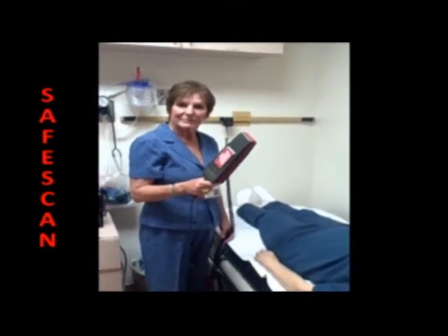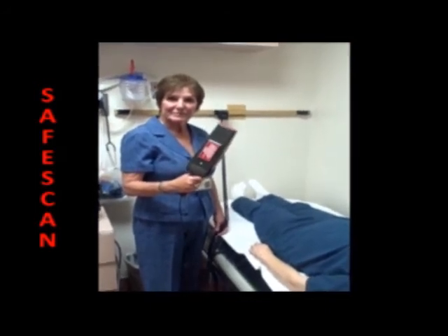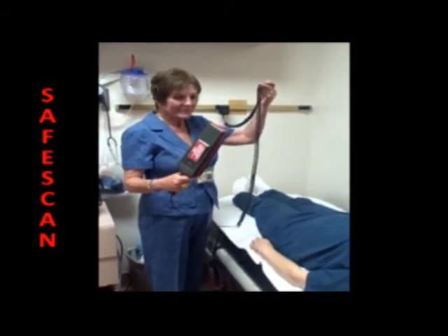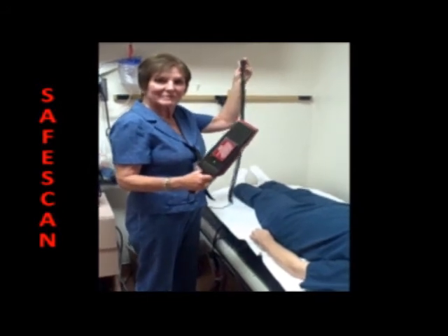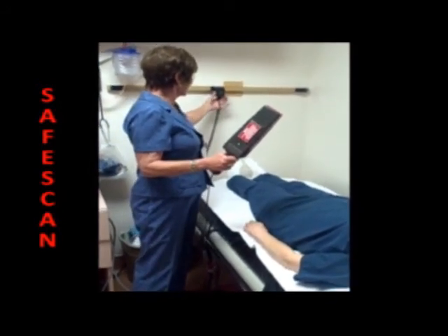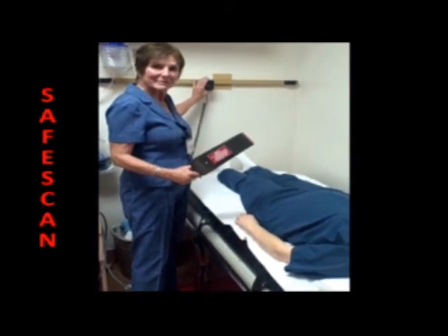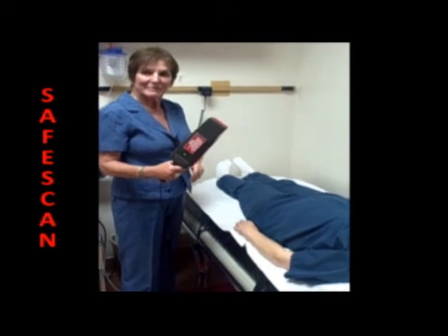For safety purposes, since the SafeScan target scanner does have ferromagnetic components, it is tethered for safety. The operation of the target scanner is entirely in DC mode using a 12-volt AC-DC step-down transformer, which should be tethered to the socket.